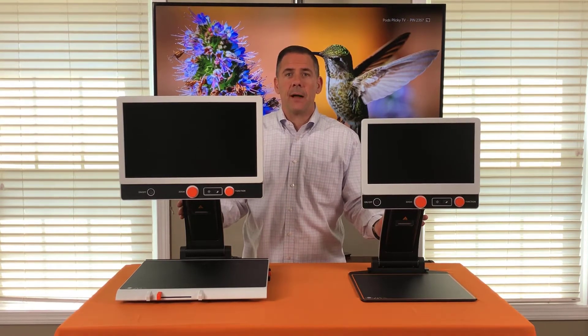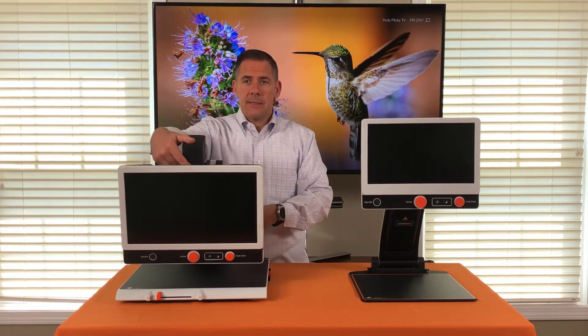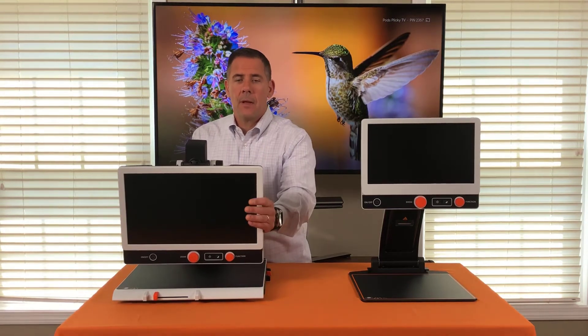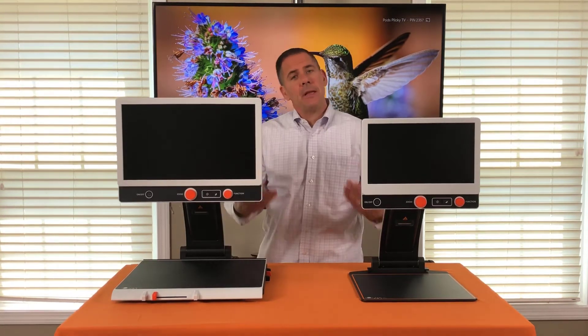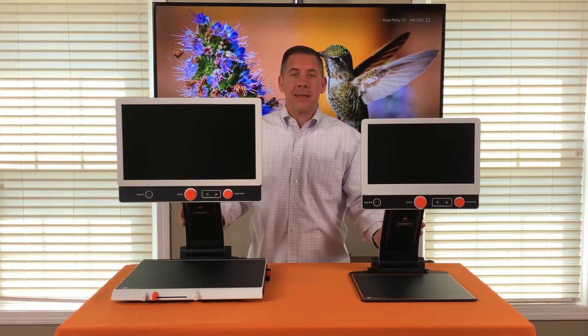They also act as a full desktop video magnifier. They have cameras that rotate for distance, self-view, or reading what's on the table. In the upcoming series of videos we're going to go through the different options the Zip series can offer you.